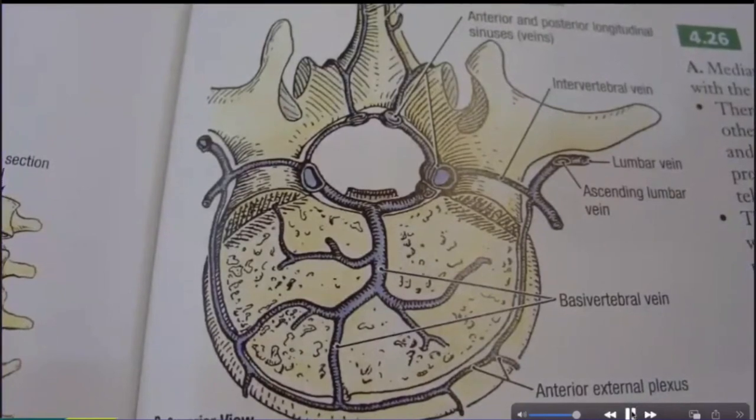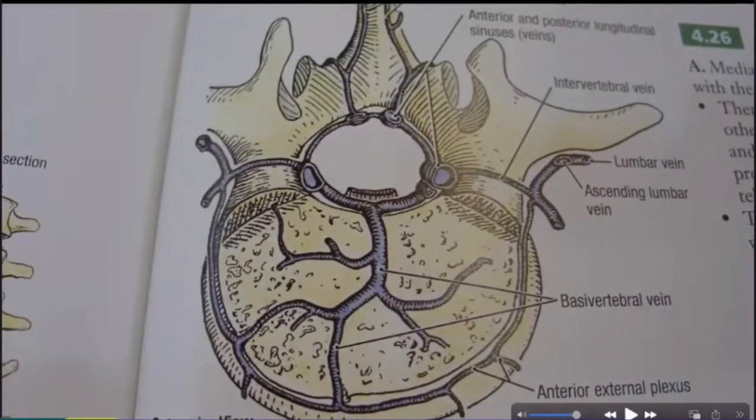Keep in mind this morphology. Your needle might be right in front, but you start injecting cement and it may just regurgitate back into the basivertebral vein foramina, you know, here. So you don't have to worry. It's not in the epidural space. It's not in the spinal canal per se. It's in one of the venous systems. Wait for 10, 15, 20 seconds. Let the cement harden itself, embolize itself. Once it is embolized, you can change your needle track, needle bevel, and start injecting inside.